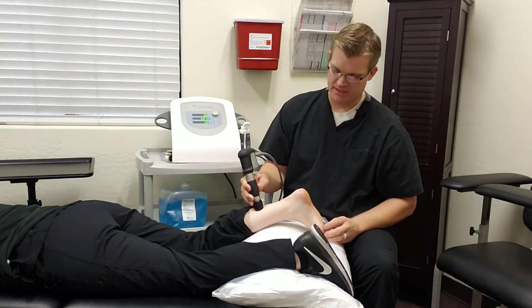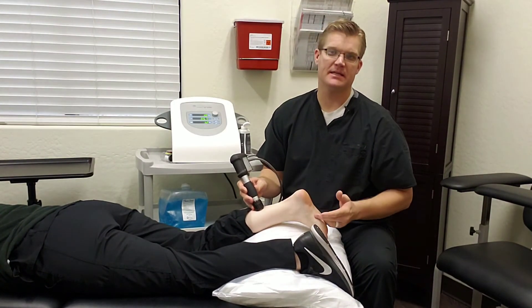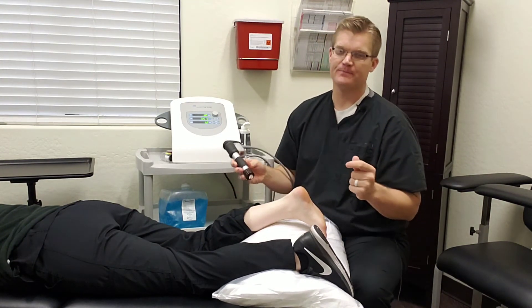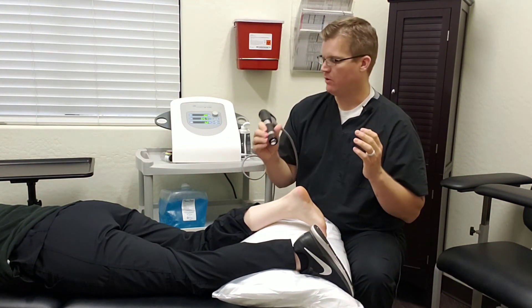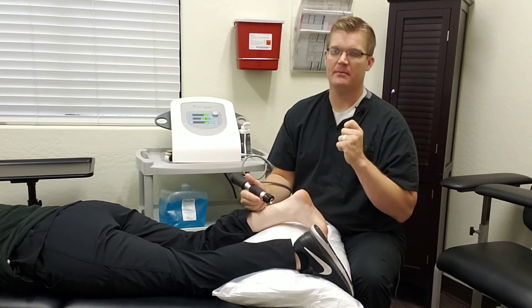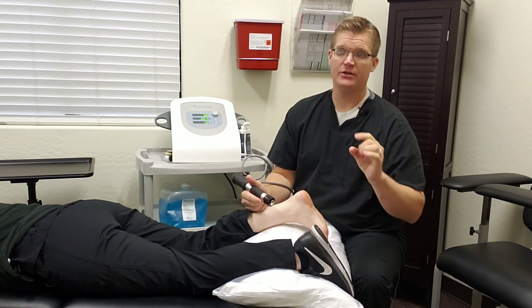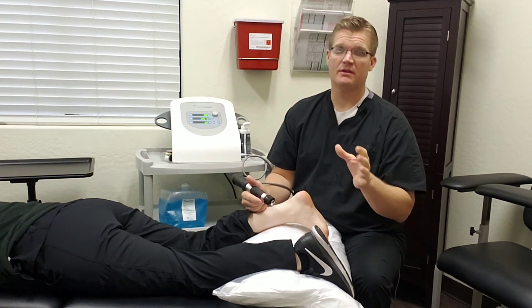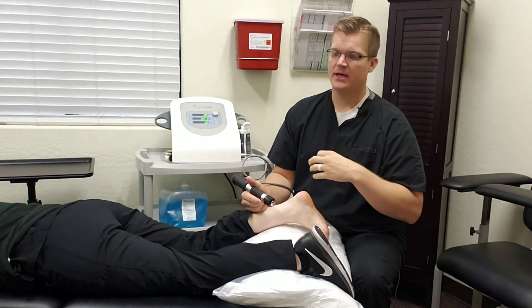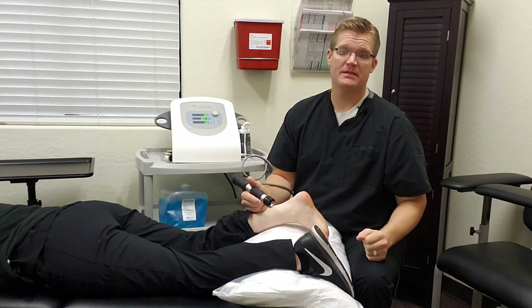Achilles tendonitis and plantar fasciitis are very commonly linked together. Overall, treatment outcomes are very successful — there's a little discomfort, but after a few weeks of care, usually twice a week with a few days of rest in between, four to six treatments for most patients, and then you're back to the activities you'd like to do.